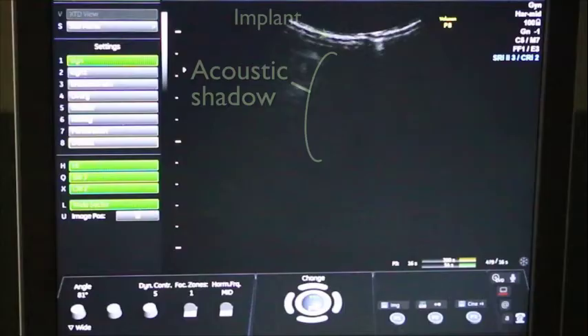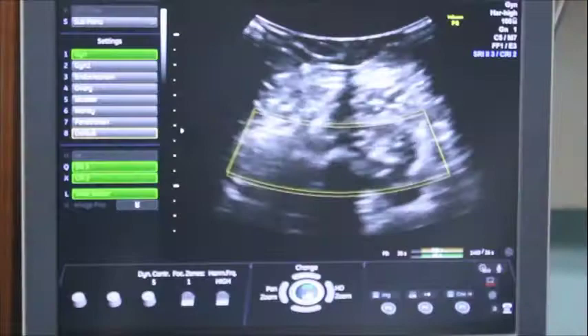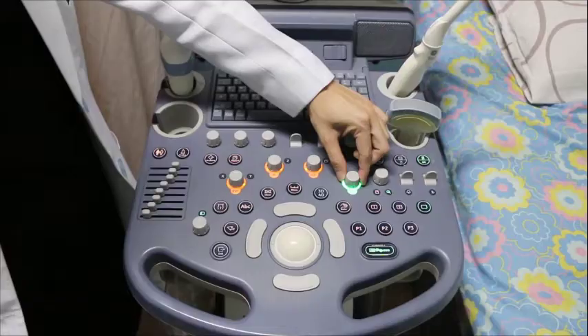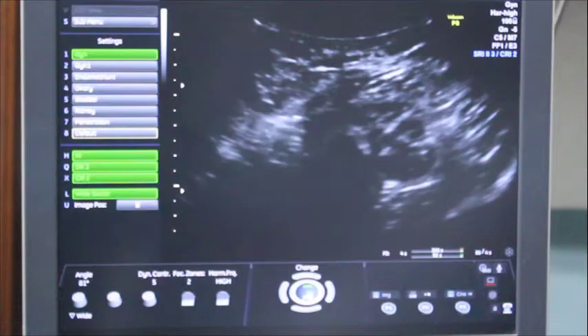When using any of these probes to scan for the implant, be sure to have the highest frequency selected on the machine. Initially, you can look with an increased depth to help identify the acoustic shadow. Then the depth should be switched to the shallowest possibility, around 1 to 2 cm, indicated by the depth indicators on the screen. Optimize the image by adjusting the overall gain and individual gain to get better attenuation through the tissue.